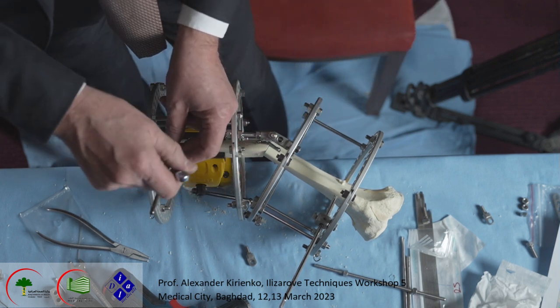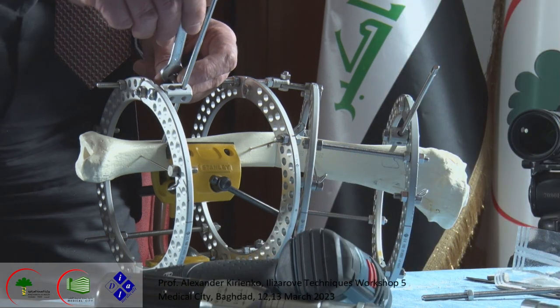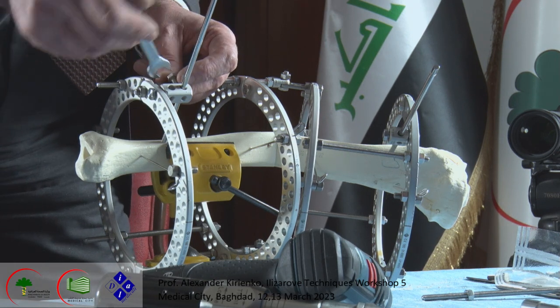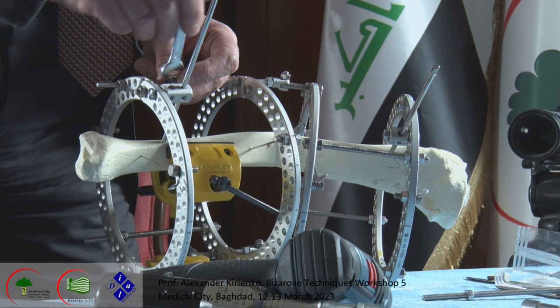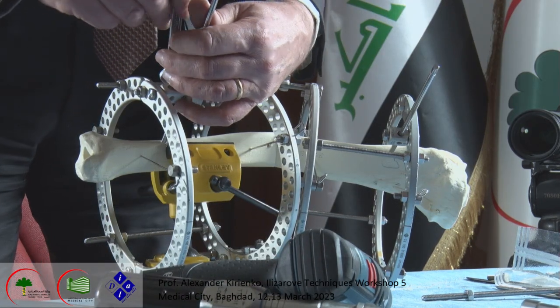They go to the fibula and the tibia from the lateral side, but remain under the skin, only at the level of the cortex of the fibula. Okay, now we fix this. It's just much more stable.